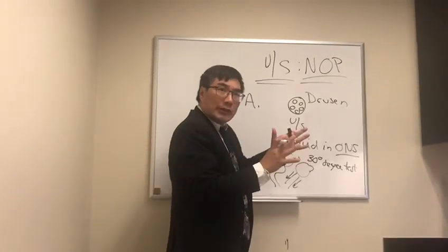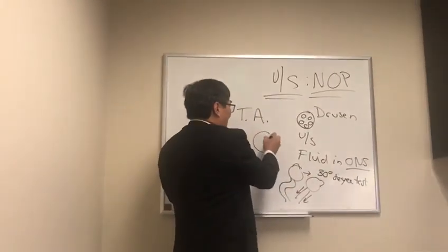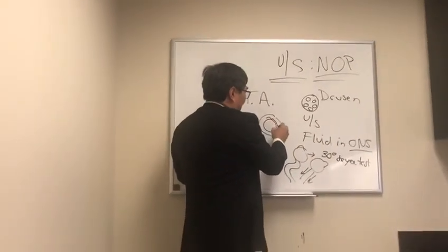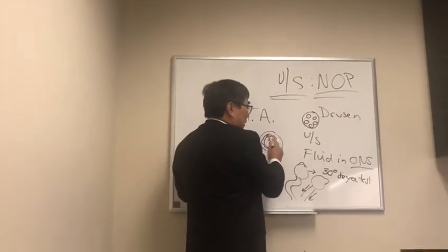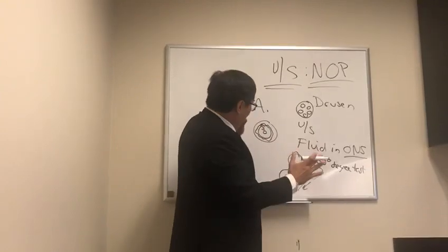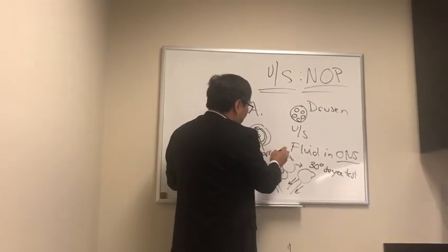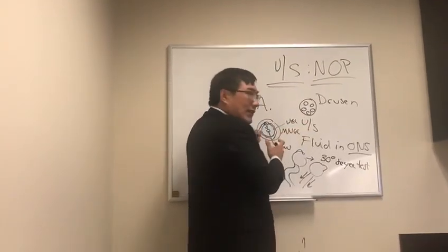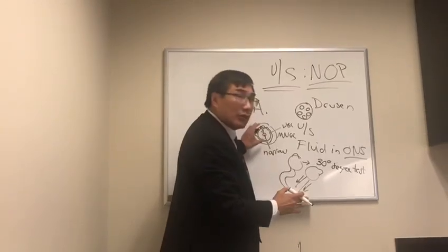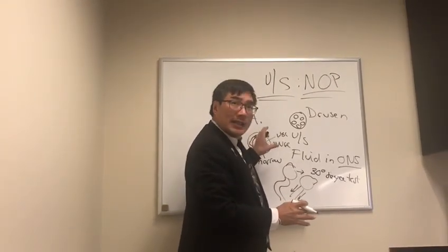So in the temporal artery, we normally would do a temporal artery biopsy. And what we're looking for in the temporal artery biopsy is the internal elastic lamina is disrupted, and that leads to inflammation, lymphocytic infiltration, thickening of the wall, and the narrowing of the lumen. And because there's white cells and a multinucleated giant cell, pathology specimens of the temporal artery can show active temporal arteritis. But ultrasound is also able to see the same things.